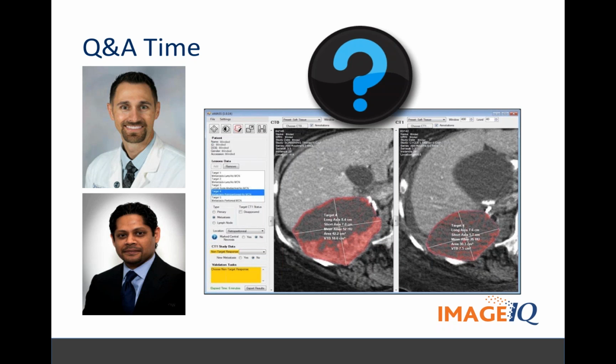Great. Here's another one from Chris as well. It says your tumor metrics right now are 2D, right? They're area metrics. Is there a good reason to use 3D? It might save you from doing ROIs over the wrong slices. What's the thought on 2D versus 3D, I guess? Yeah, absolutely. I think 3D is probably the way to go.